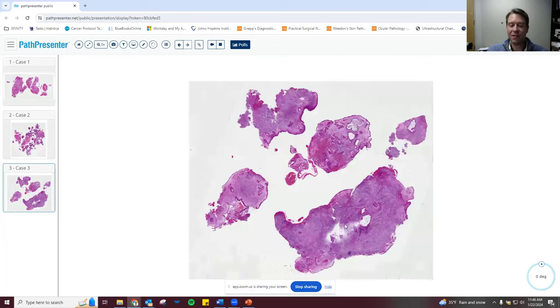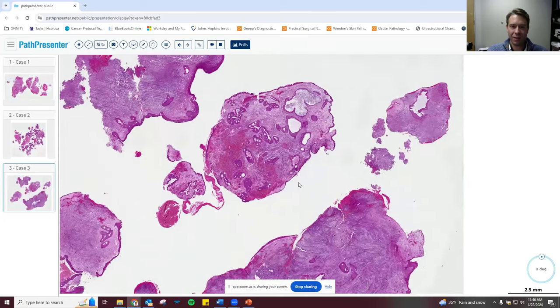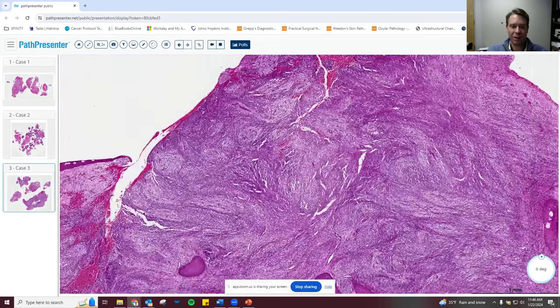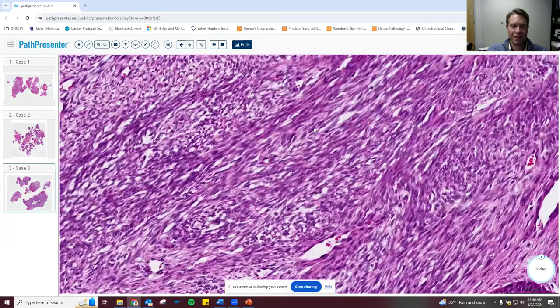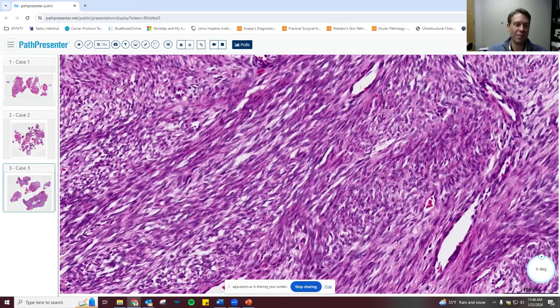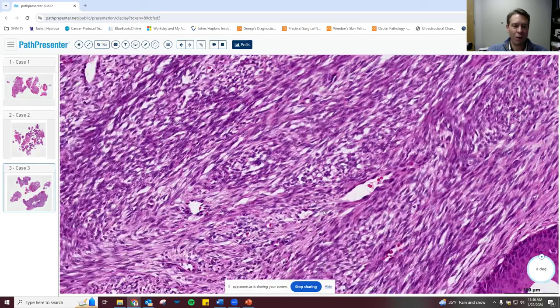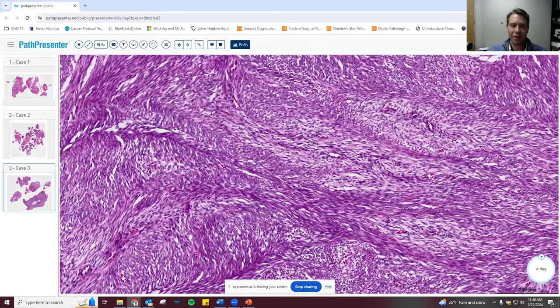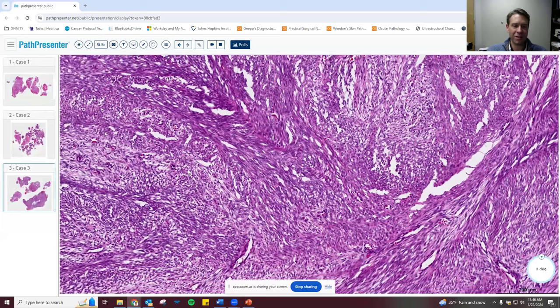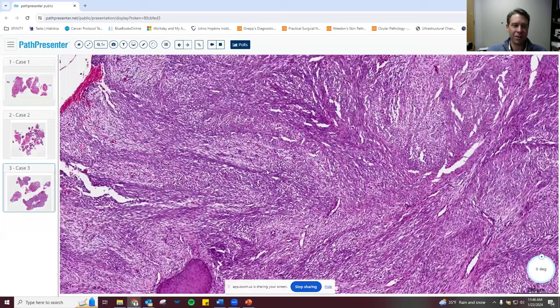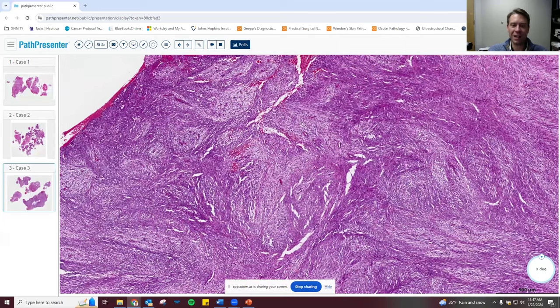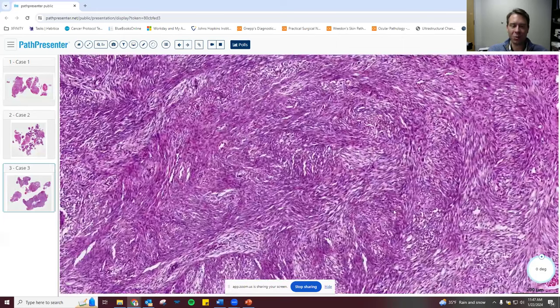Case three: a 72-year-old woman with a 2.6-centimeter nasal mass. It looks too cellular with entrapped hyperplastic epithelial elements. Looking closer, the neoplasm is composed of spindled cells — some eosinophilic, ovoid, some wavy. It is positive for SMA showing myogenic differentiation, patchy positive for S100 showing neurogenic differentiation, and negative for SOX10. This is biphenotypic sinonasal sarcoma, confirmed by PAX3 rearrangements.